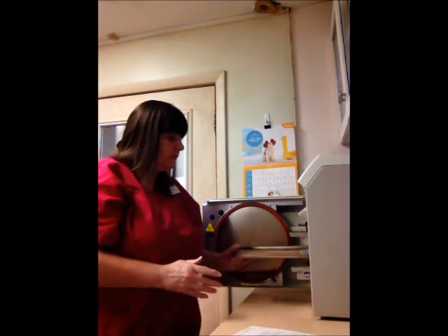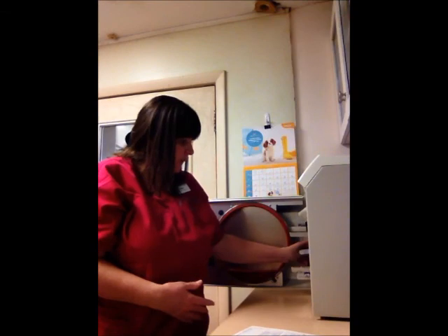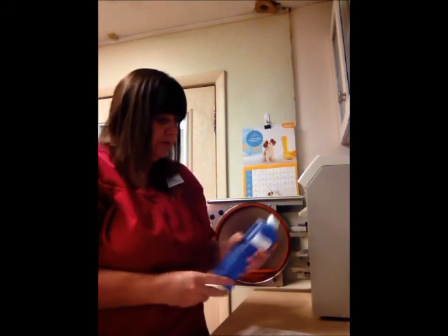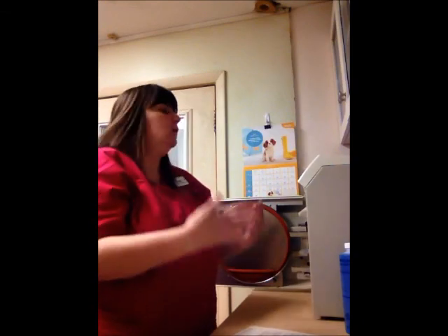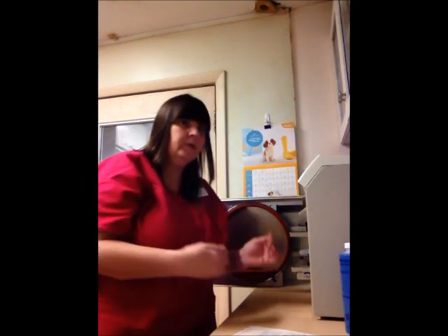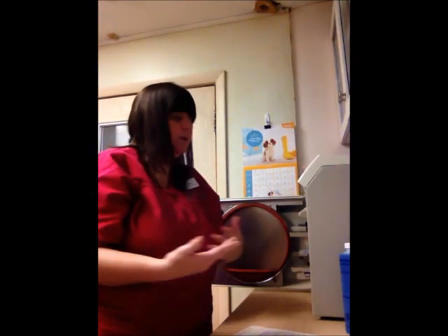Once a month, however, we clean everything and wash everything down, but we will also empty the entire reservoir. We put about an ounce of Omni Cleaner in it, which is some steam autoclave cleaner. We'll put an ounce of that in the bottom of the autoclave. We'll run it on a pouches cycle, which is about 5 minutes. We stop it right before the dry cycle starts, right after it vents, and then we empty all of the distilled water out of it, refill it up with distilled water, and run it on a pouches cycle, which is 3 minutes. Or the unwrapped cycle is 3 minutes at 270 degrees Fahrenheit.